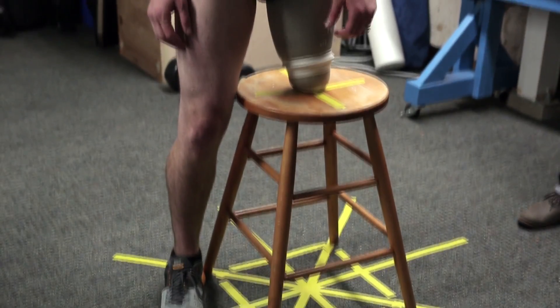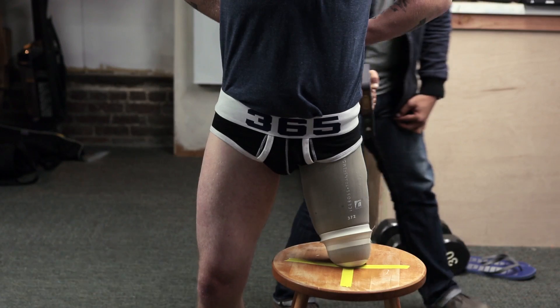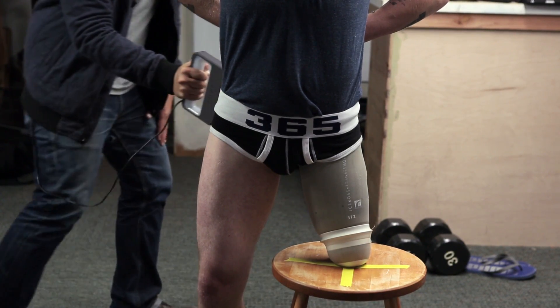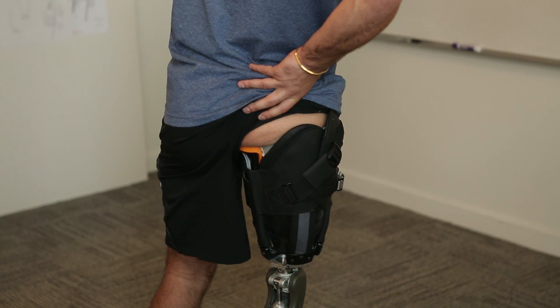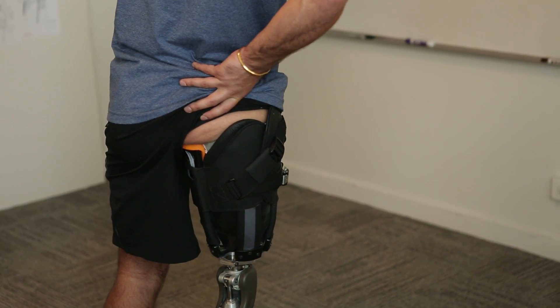The thigh is meant to transfer weight down to the foot, but upon losing a limb at the thigh level, you now have a distal stump that is not accustomed to bearing weight. What we're capable of doing is an almost bicycle seat type concept — an ischial seat, we call it.